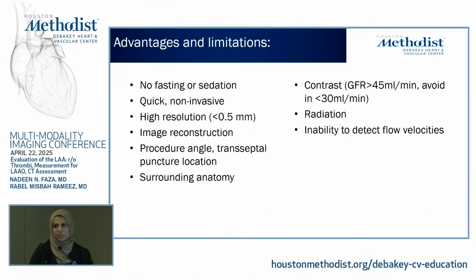Some of the advantages and limitations: we talked about some of the issues with TEE, where patients are fasting and maybe require an additional bolus of IV fluid. Patients who are coming in for CT do not require fasting or sedation, and it allows us to image the left atrial appendage at its max size. It's quick and non-invasive. It allows us to have high-resolution images with most of our modern CT scanners.